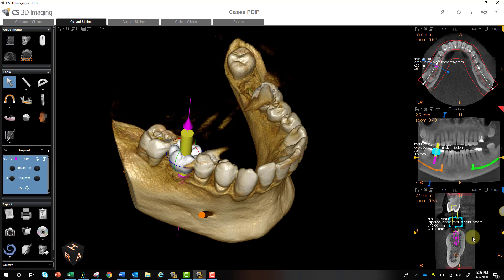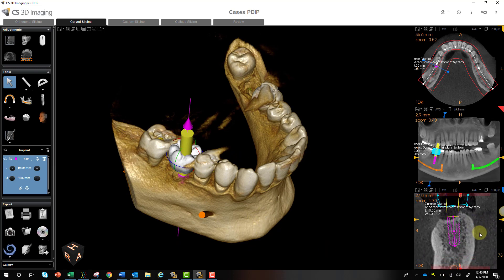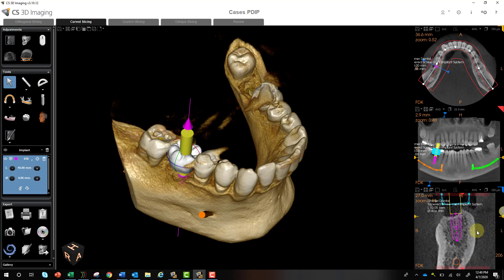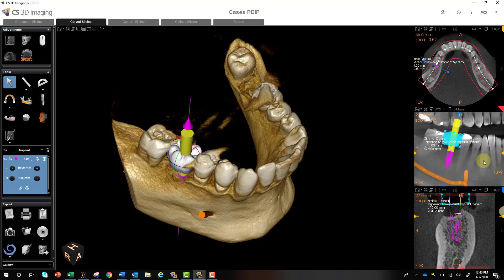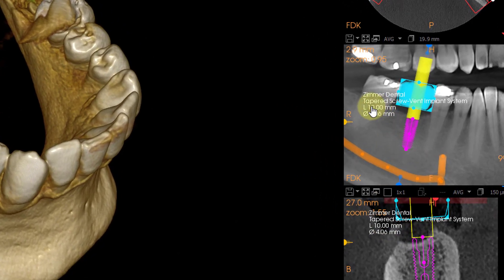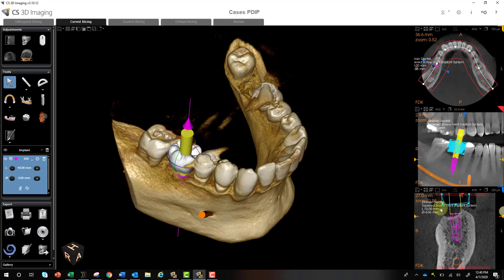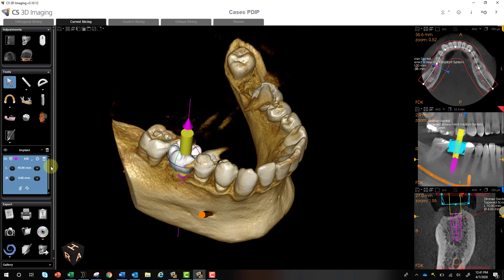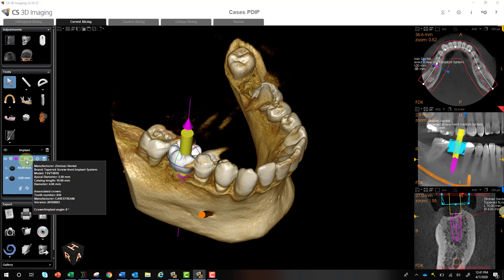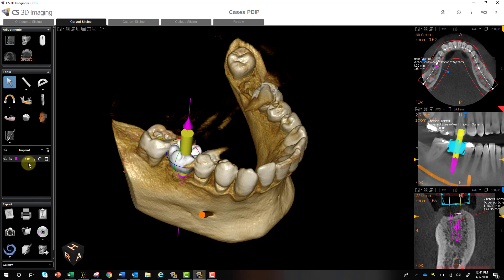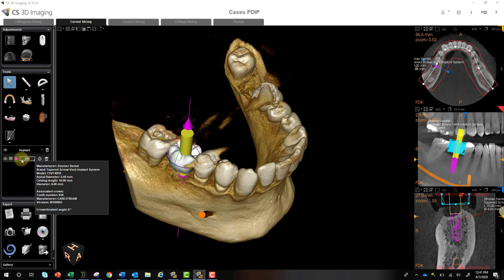Now we can actually change the angle of the implant. Zooming in on the cross-sectional view gives a much better canvas to work with, and you can do the same for the panoramic curve. You can also see the label or object properties showing the specific implant, size, and dimensions. If these get in the way, you can left-click and drag them aside, or on the left-hand side you can left-click the blue bar to close or open that entire window.